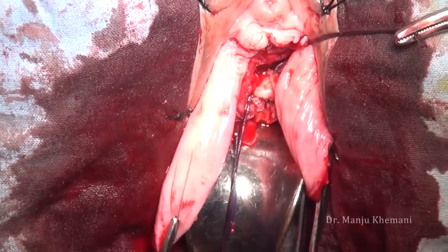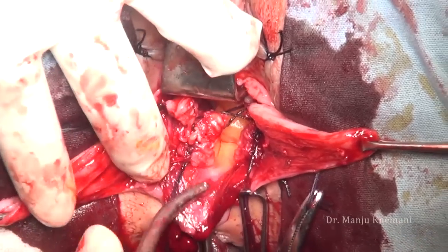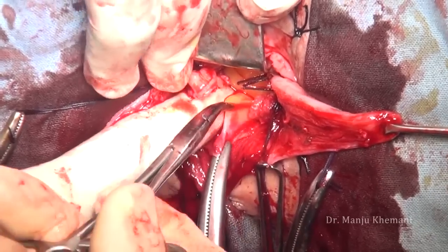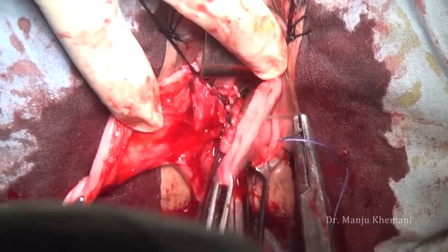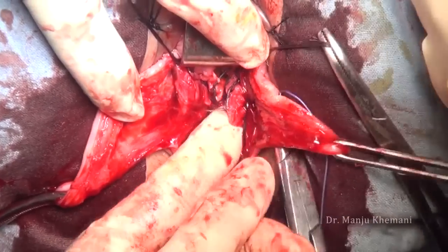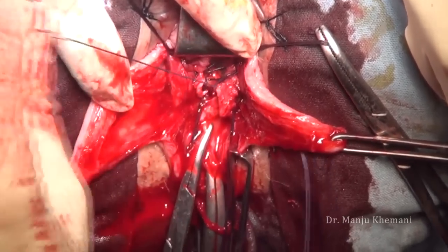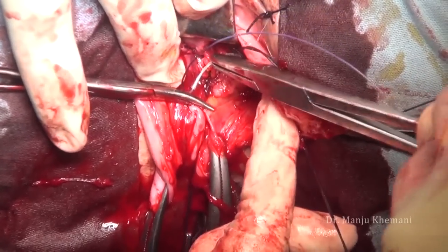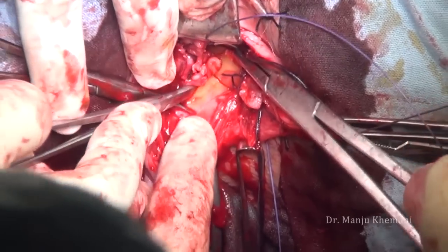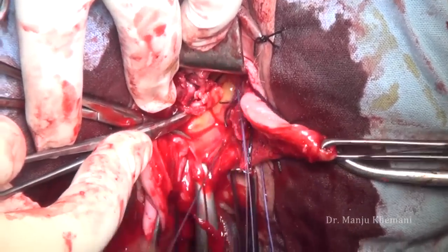Once you have removed the uterus, empty the bladder, because by this time the bladder will have filled up again — and if the bladder fills up, the peritoneum is pulled up. To prevent recurrence, always pay attention to enterocele repair. I am doing an external culdoplasty so my suture goes through the vagina, uterosacral, and cardinal ligament. The gap between the cardinal/uterosacral ligament and the peritoneum — one bite should always be taken here to prevent later bleeding. The culdoplasty suture will prevent recurrence of the enterocele.